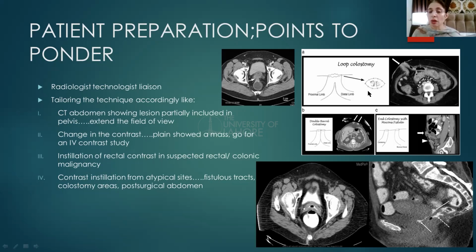So the idea is to have the knowledge of these types of variable, different circumstances that can arise in a busy department, which is different from the routine study, and how to handle them and how to tailor your technique according to the requirement.